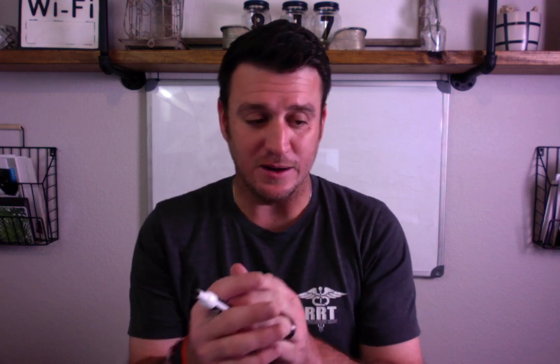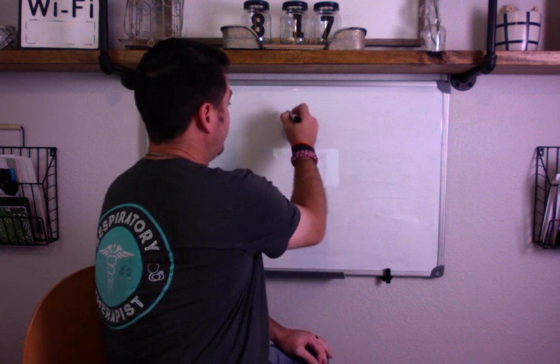basis, okay? Now, also this has to do with the fact that we're going to talk primarily about volume control ventilation, which if you live in my area, is primarily the mode of mechanical ventilation. Now, if you live in an area where it's more pressure control ventilation, then your dyssynchrony looks different. The problem is still the same, it just looks different, and we'll touch on that also, okay? So what we're going to talk about first is, I'm going to draw some waveforms up here.